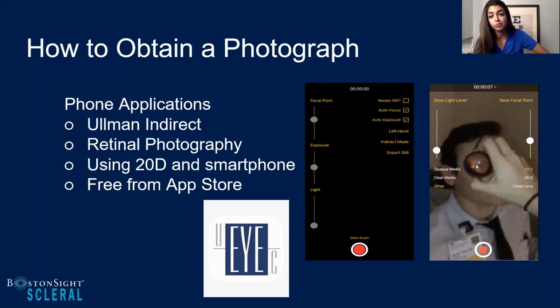The other reason why I really like this is I'm guilty of unsteady hands. And so this application really gives you a video. And as we know, dynamically, there can be a lot of movements. The video is able to capture a lot of information, and on a provider level, whether it's fluctuations in the quality of the image, to even just looking at fluctuations on how that lens looks like on the eye. Also, the video can be shot in various lengths, and you can really break up the videos. My recommendation is to keep them short and sweet, so 10 to 15 seconds is perfect.